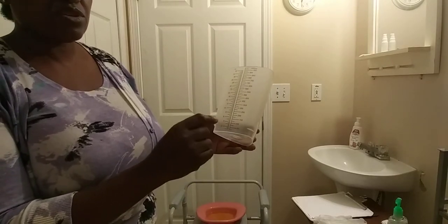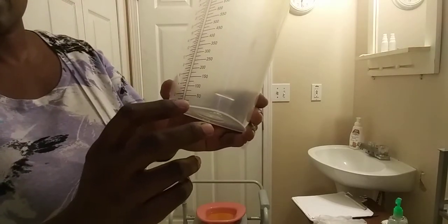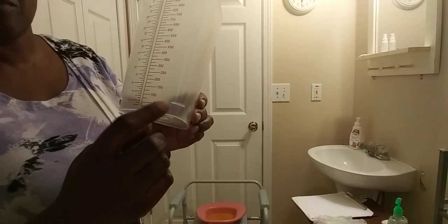For this container, you want to make sure you check the graduate. We have ounces and cc — you want to make sure you are not documenting in ounces. We normally document urine output in cc's or mls, milliliters or cubic centimeters. As you can see, it's graduated from 25, 50, 75, and 100. Make sure you keep to the cc or ml side.